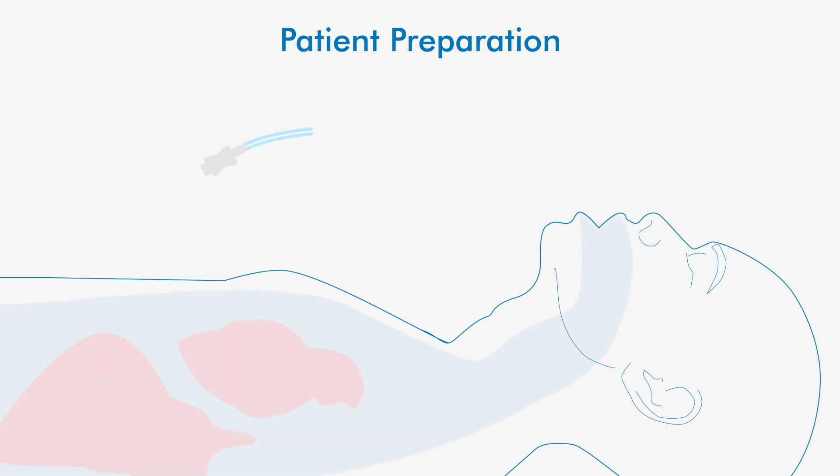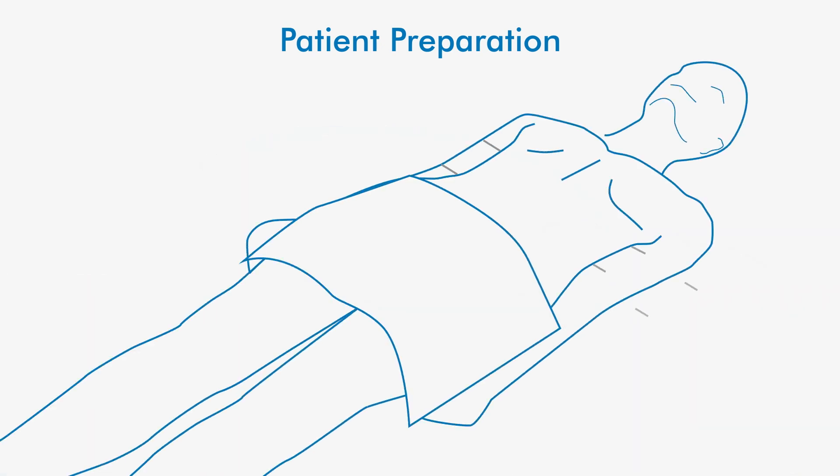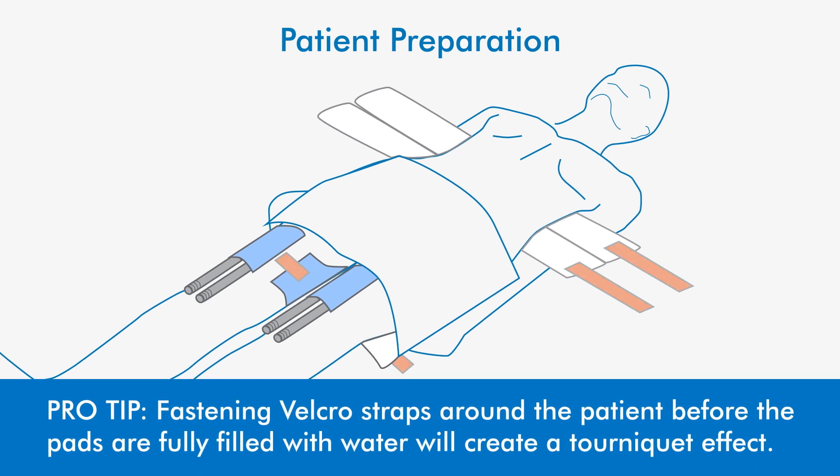Ensure the patient core temperature probe is placed per hospital policy. Lay the hyper-hypothermia pads flat under the patient, with the navy blue side facing away from the patient's skin and the white side of the pad on the patient's skin. Do not fasten the elastic Velcro straps around the patient until filled with water.